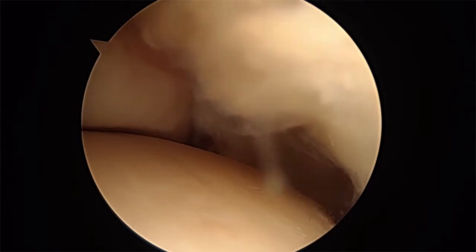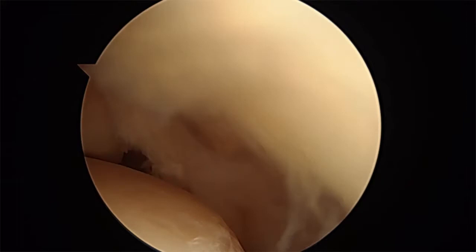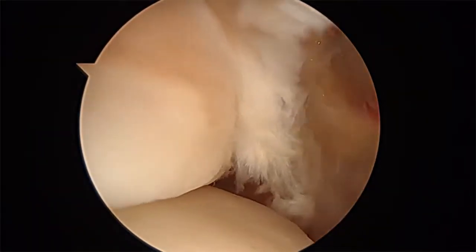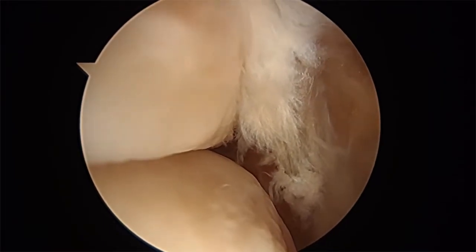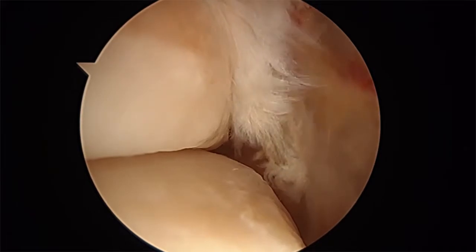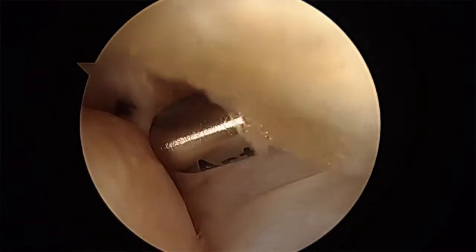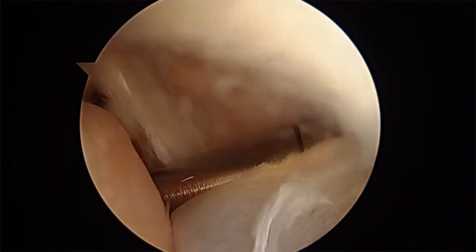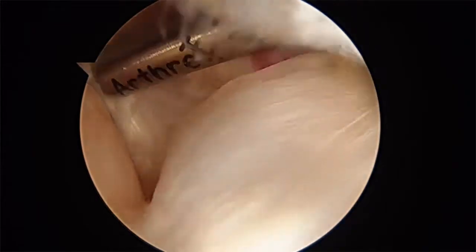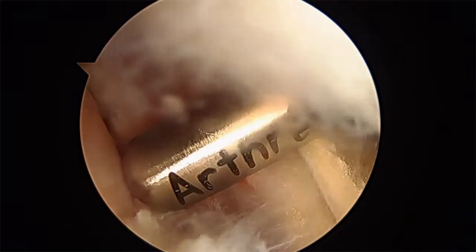So the anterolateral gutter looks to be clean — actually, there's still a little bit more right here. I'm going to go get that — that little piece right there on the side. Flex the ankle. Get some of that synovial tissue out. This is the syndesmosis we're debriding. Go in the lateral gutter.